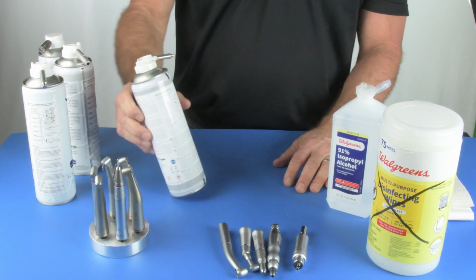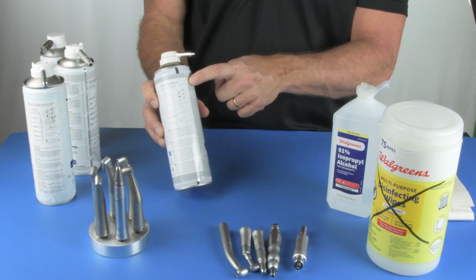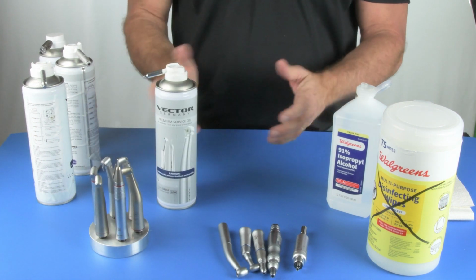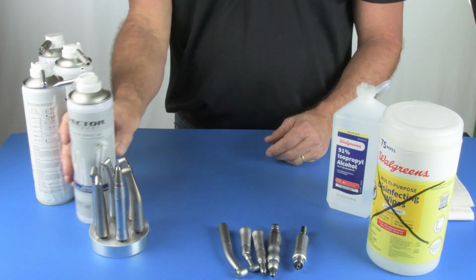It also has a very handy chart on the back which tells you how to match up the different types of adapters to the different types of handpieces so you can always do this correctly and get the right one. We highly recommend Vector Spray, but if you don't have Vector Spray, you can use Keva Spray. There's very few others that I would recommend, but they are basically the same oil.